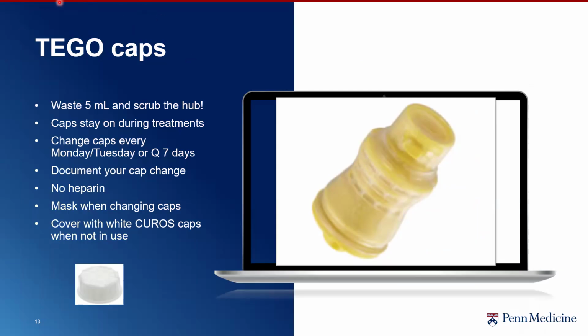So over the last couple of years, we switched over to Tego caps. The Tego caps are the ones that go on the end of your dialysis catheter. These are changed every Monday and Tuesday or every 7 days, and they do stay on during treatments. They're less caps and more of a valve. One of the things that I've noticed is nurses not documenting their cap change. The cap change is done, like I said, every Monday, Tuesday, or every 7 days.